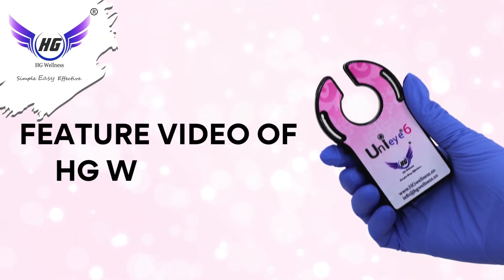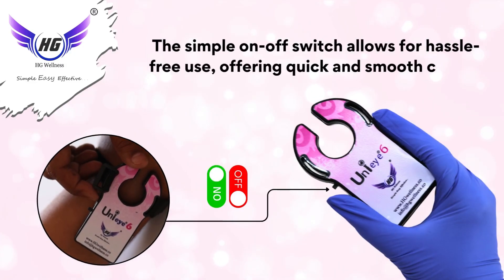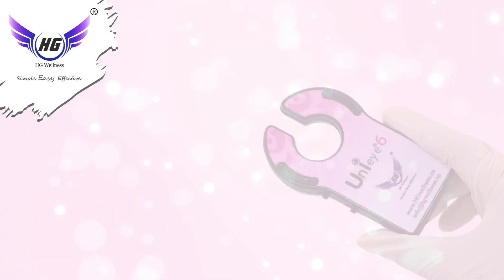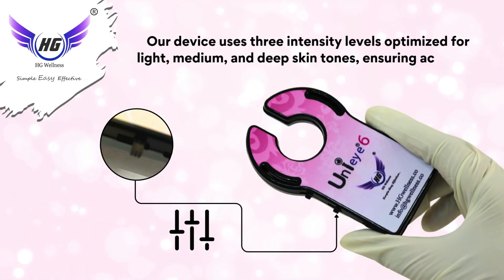This is a feature video of the HG Wellness Uni i6. The simple on/off switch allows for hassle-free use, offering quick and smooth control right at your fingertips. The device uses three intensity levels optimized for light, medium, and deep skin tones, ensuring accurate, safe, and efficient vein detection for everyone.